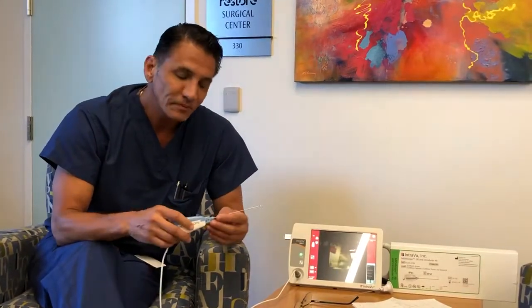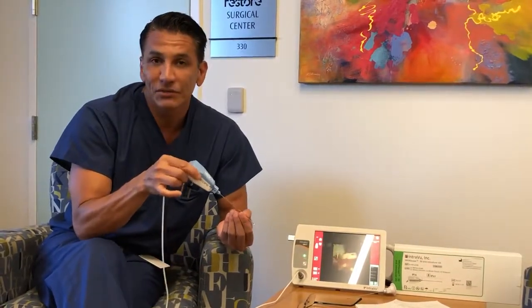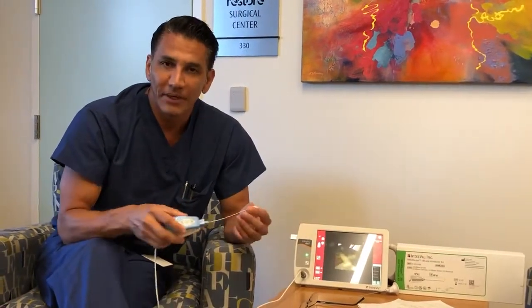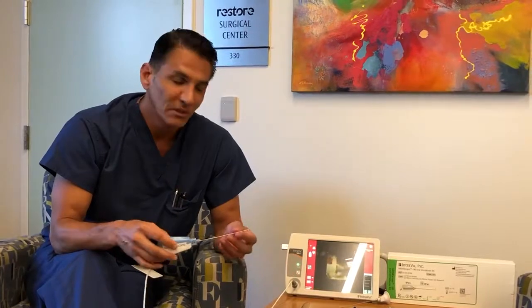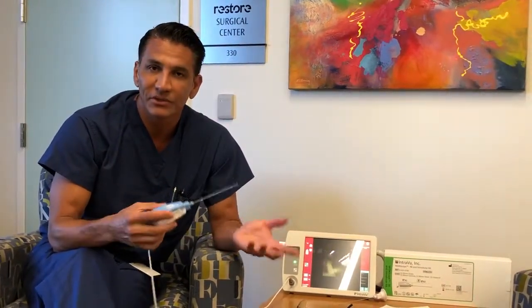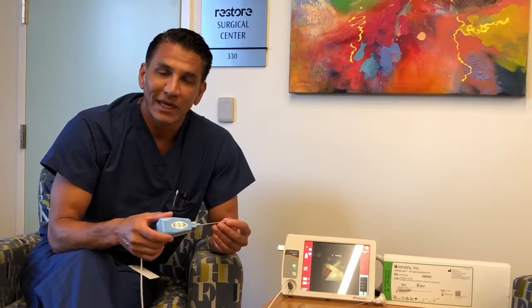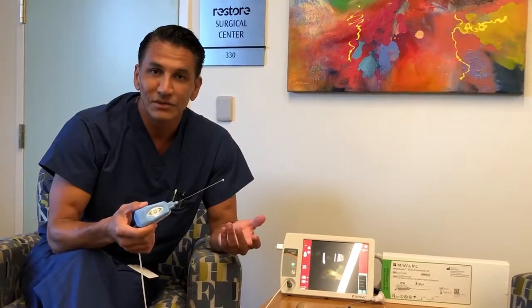I prefer to do it in my procedure room or my surgery center only because it's easier, my supplies are there. And I can put it in the knee, take a look and see if the lesion has healed or not, and then I can better educate the patient regarding the problem. So once again, post meniscus repair, post microfracture, post MACI surgery, articular cartilage or chondrocyte transplantation. I think those are really good reasons, and probably the most beneficial, and it makes sense to use a needle scope in those situations.